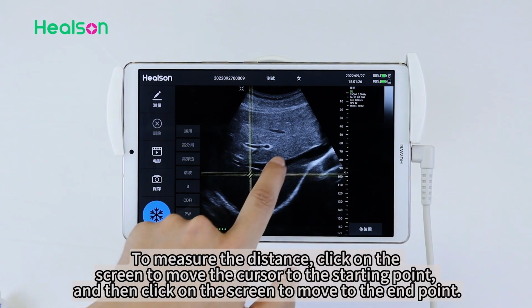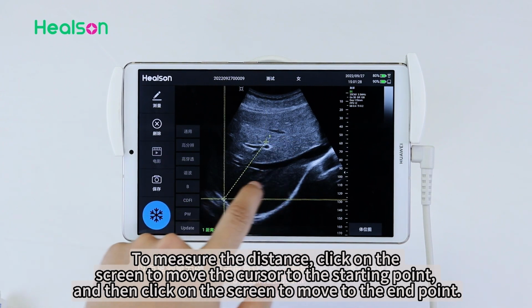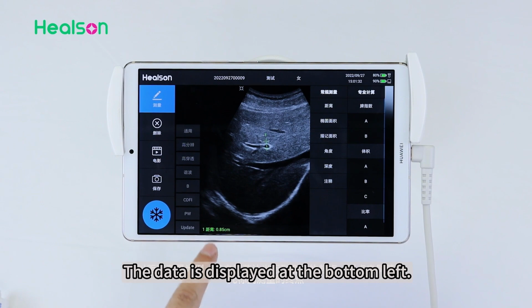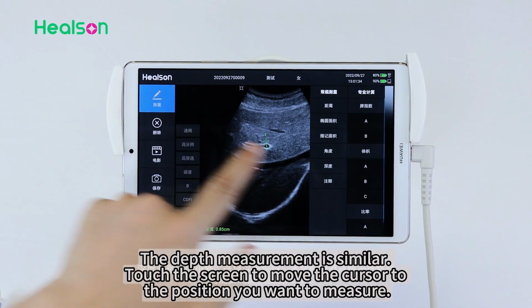To measure the distance, click on the screen to move the cursor to the starting point, and then click on the screen to move to the end point. The data is displayed at the bottom left.